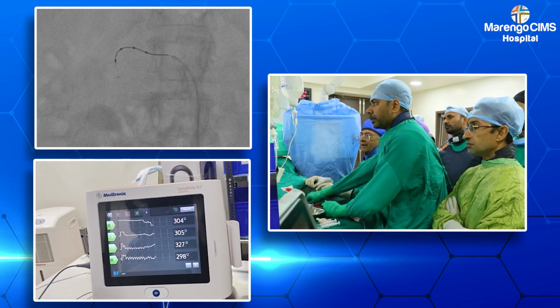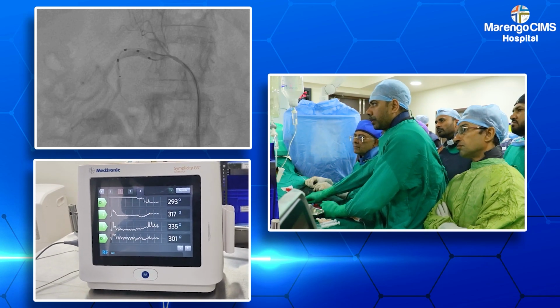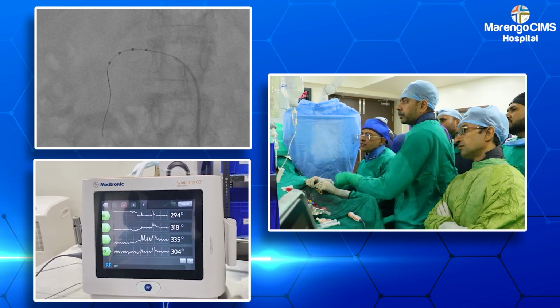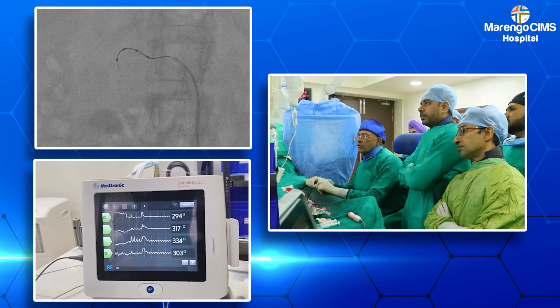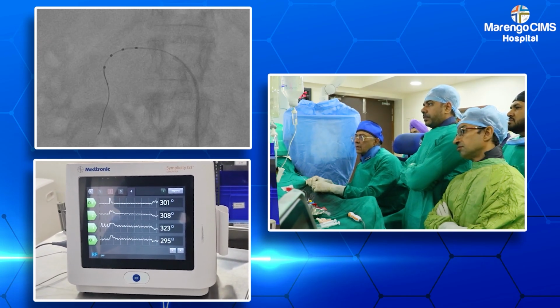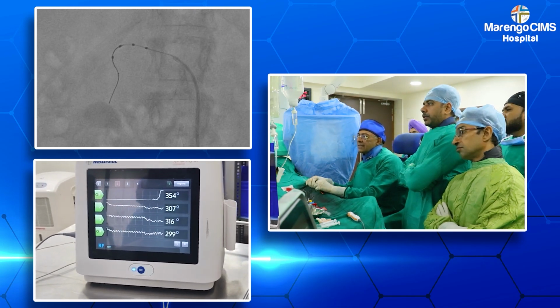So we have pulled back the wire and we'll do a small, very little dye, 1/4 cc. Fantastic. Go down. So we may advance a little bit, but the concertina effect has gone away. The blood is flowing very nicely. So we will ablate that proximal 5 millimeter segment. Okay. Advance a little bit, record.